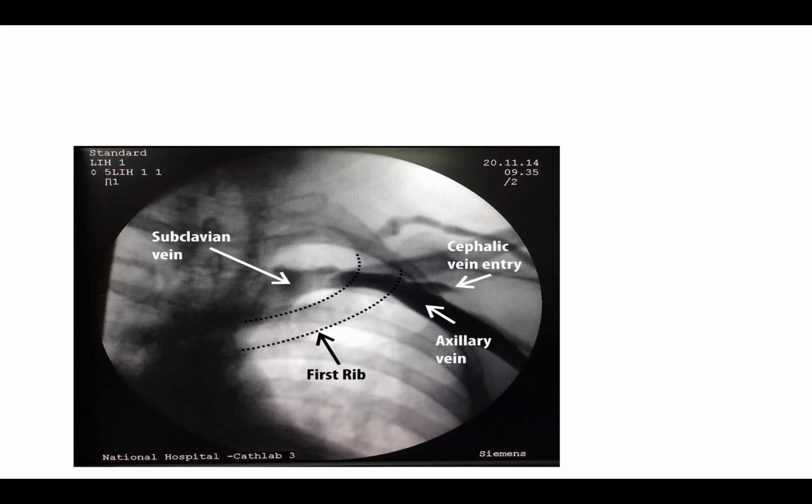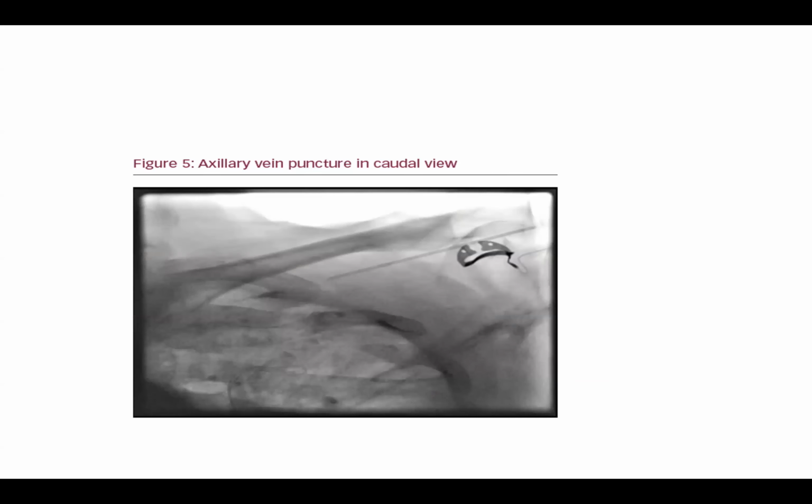You can also try it, do a venous puncture, combine venous and fluoroscopy, you will have fantastic results.